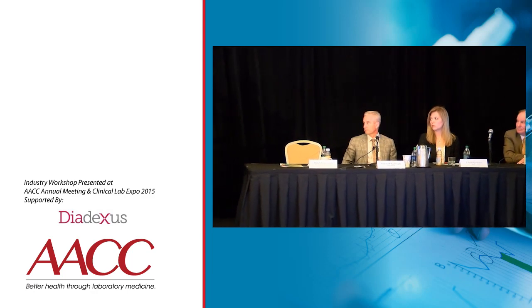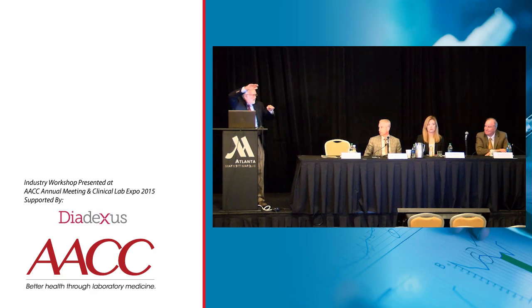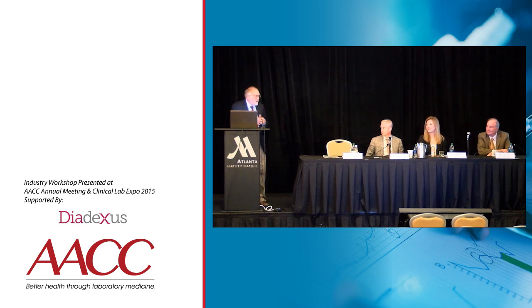As I listened to Leslie's talk, though, and this was related to Dr. Toffolides, it seemed to flatten out at the top and maybe at the bottom with the concentration assays, where it was more of a straight line. We've talked a lot about the mass assay and issues with it, but it has been over time a pretty darn good test, and there's been a lot of data on it. Do you think the data are conservative? In other words, if the activity assay had been run on those samples, do you think it would even be better? What do you guys think about that?